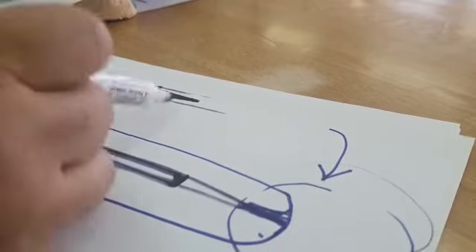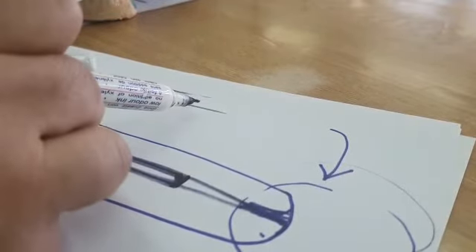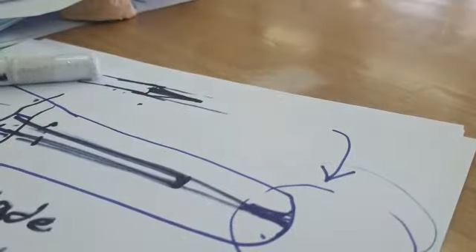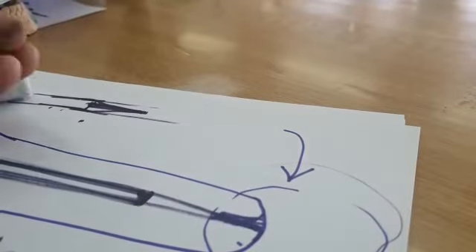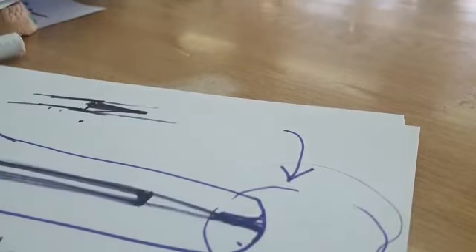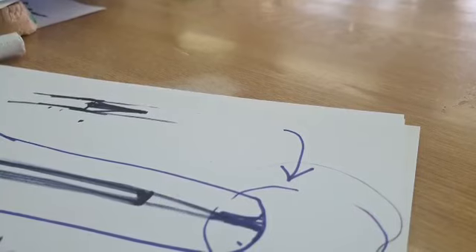So these are only provided by some companies. Not all companies have them. With the kit that they provide for a post, they also provide a drill for post removal. Okay, so these are the ways to safely take out the post if you need to do another one. Why do you need to do another one? Because it's fractured and now it's closer to the root. How am I going to bond a new core to it? It's not enough to bond a new core. Okay, thank you.